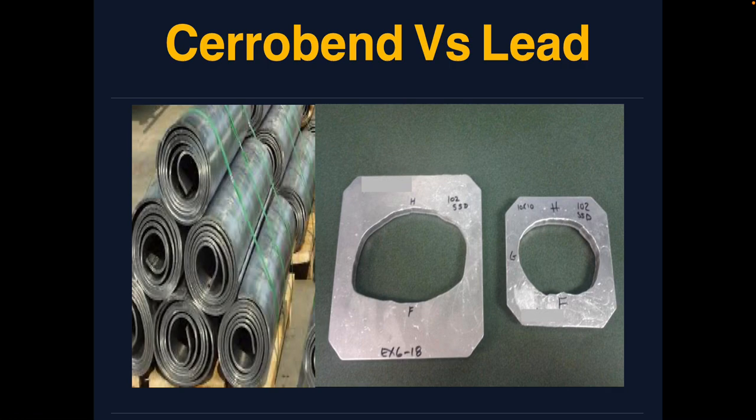There is also what we call the Cerrobend. And Cerrobend is a very common MCQ question. It comes to you in the form of, what is the Lipowitz metal, or Cerrobend? It's under the name of Lipowitz, L-I-P-O-W-I-T-Z metal, or Cerrobend metal. And the composition of this Cerrobend also comes in the MCQ, unfortunately. It has bismuth, lead, tin, and cadmium. BLTC, whatever you want to remember. Cerrobend, Lipowitz, or BLTC. Unfortunately, it comes in the exam.